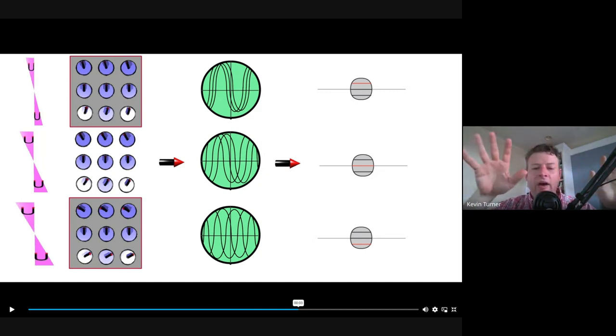Those protons were going how? They had what phase? That means it goes over here. That ear belongs here on the image. Okay, now the gradient turned on and these protons were going slower. Okay, how slow were they going? That means it goes here. So the gradient is using precessional frequency to tell the computer where those protons go. All right?